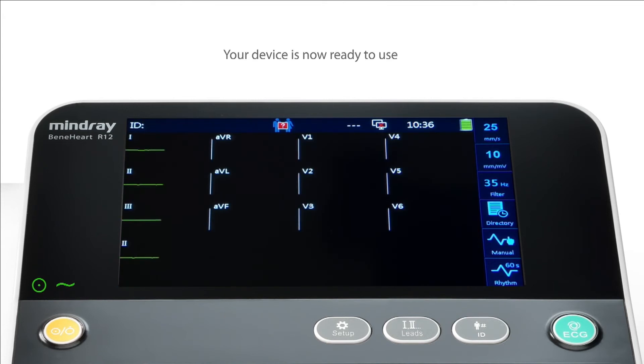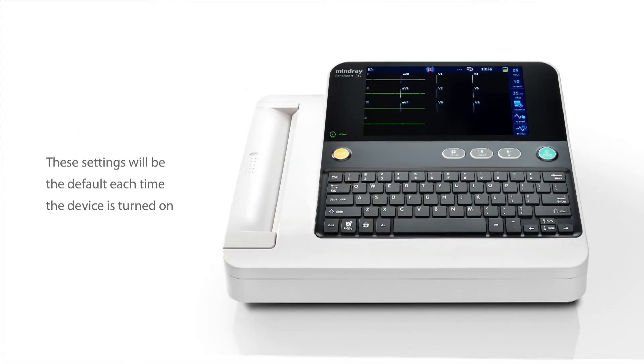Your device is now ready to use. These settings will be the default each time the device is turned on.